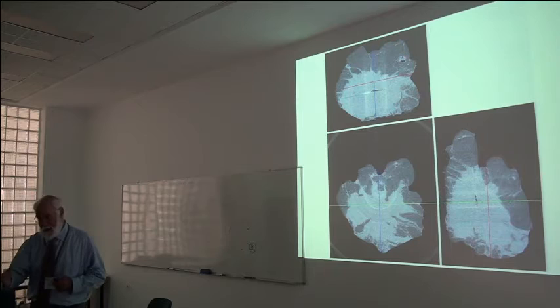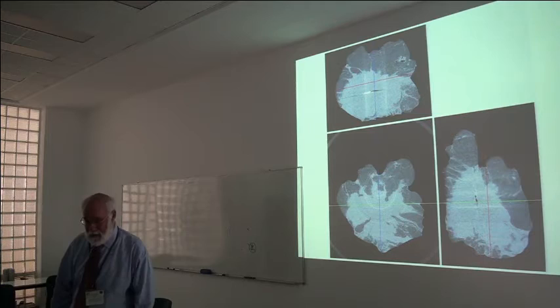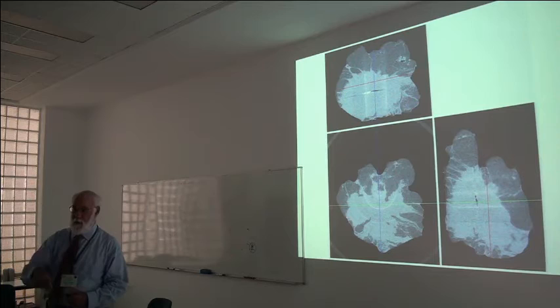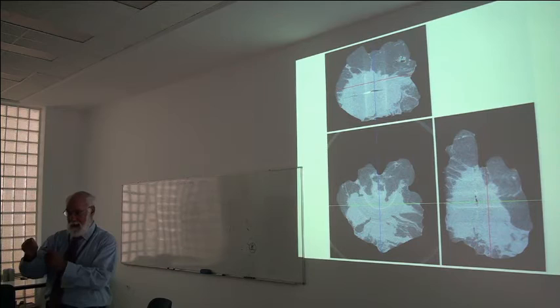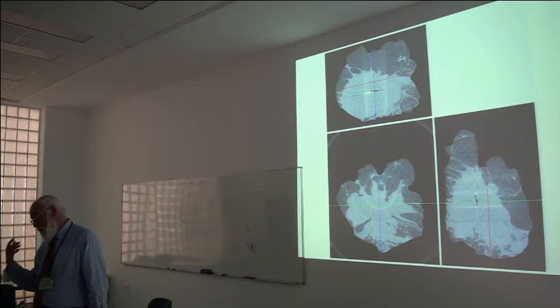I would say to these companies, "How many machines did you sell last year?" 175, they'd say. I'd say, "How would you like to sell 5,775 machines next year?" Because that's how many hospitals there are in the United States. So we are working with Bruker and General Electric and Nikon to say, let's take an X-ray picture, but while we're spinning it around, let's go up and down and do an optical coherence tomography picture of just the top millimeter. We can't see more than a millimeter or two in, but that's all we really need to see. So, combining this with optical methods, and then, I'm sorry, I'm blabbing on too much.